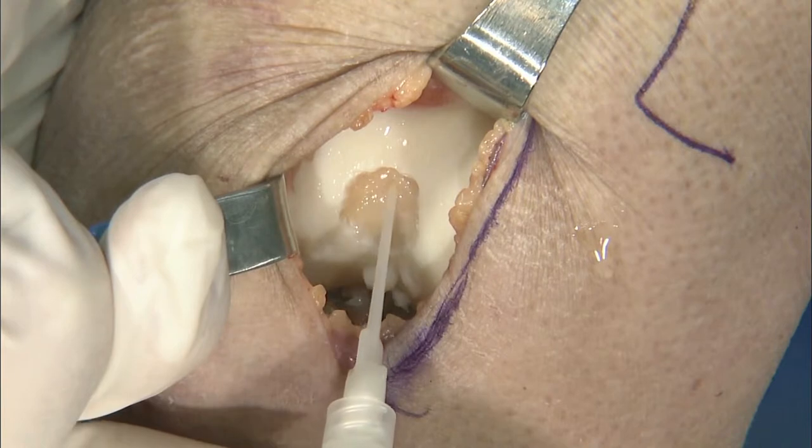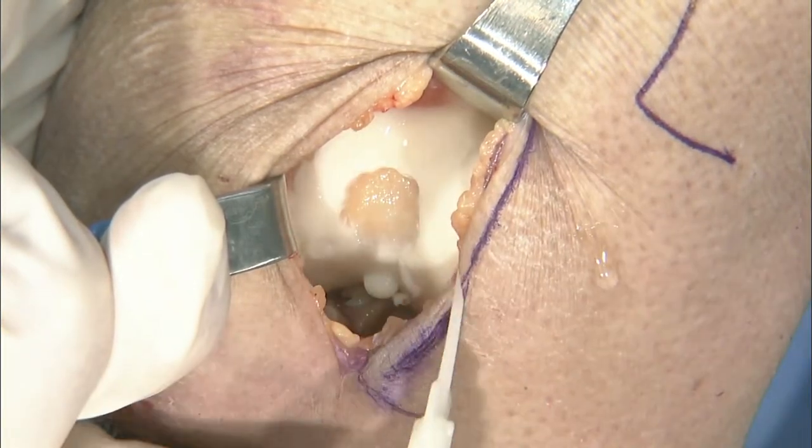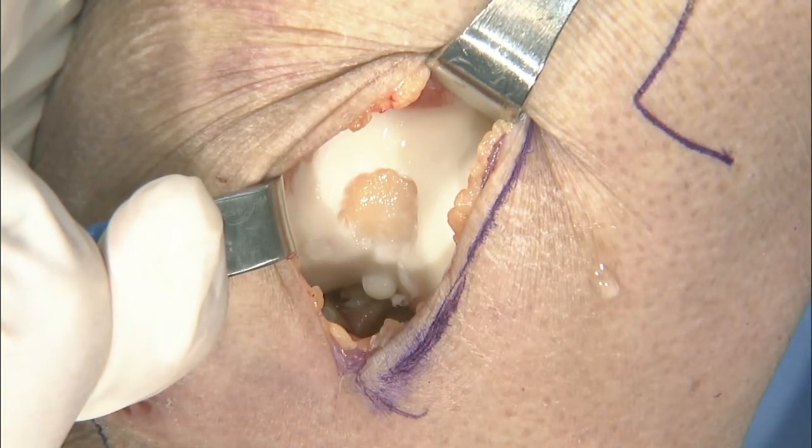I can see that it's not really running on the lower side. It's not running down here. I don't have a big gob of it over the top of it right there. And I think that that's probably more than enough in this situation.